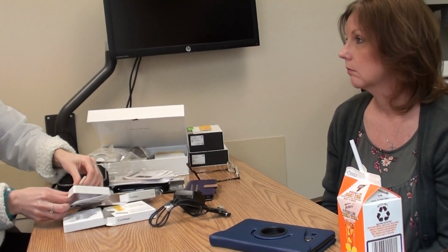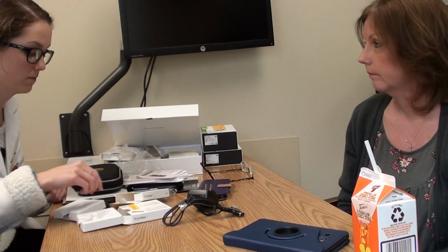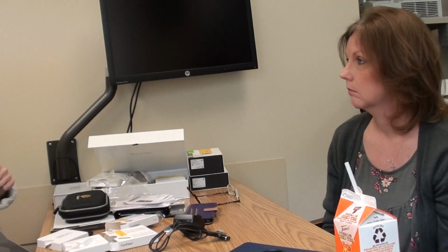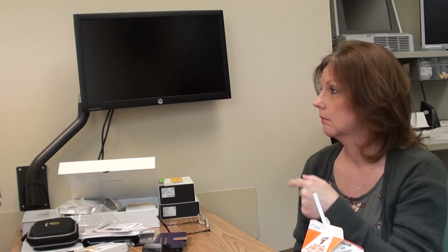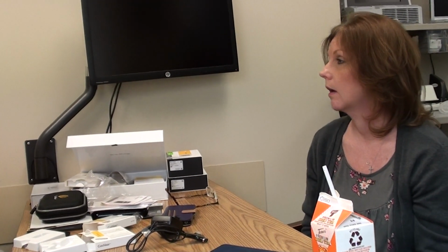You have a couple extra batteries, so rotate through them. Okay. How long will the batteries last? They're about 26 hours. Is that what it said? Yeah, about 26 hours. He told me 18 last time. Yeah, it depends. That may change every time you come back. Okay.